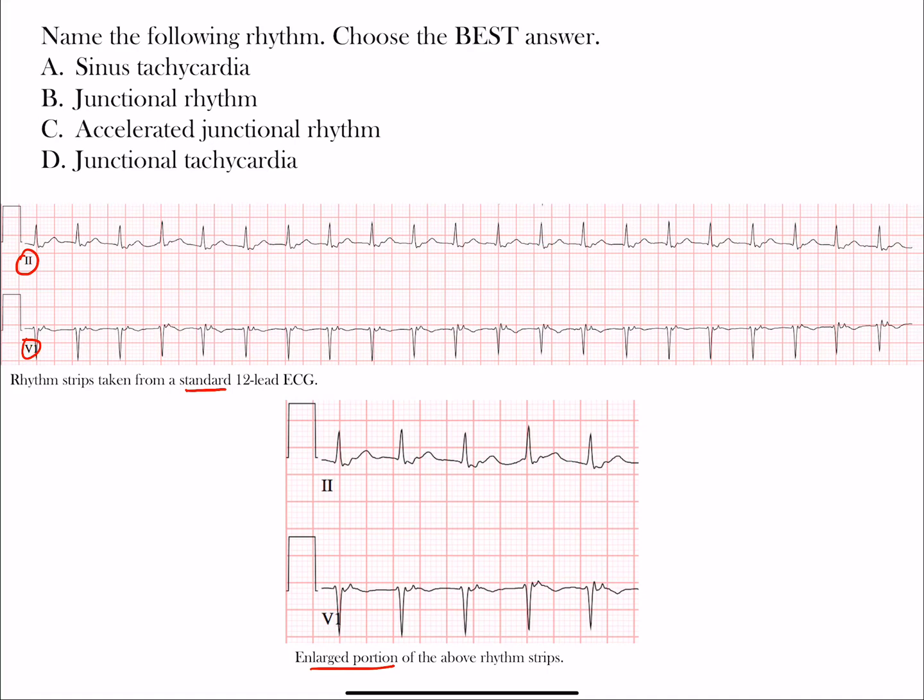You're going to look at these rhythms and choose the best answer: A. Sinus tachycardia, B. Junctional rhythm, C. Accelerated junctional rhythm, or D. Junctional tachycardia. Take a few moments, pause the video, try to figure it out, then restart and we'll go through this together.